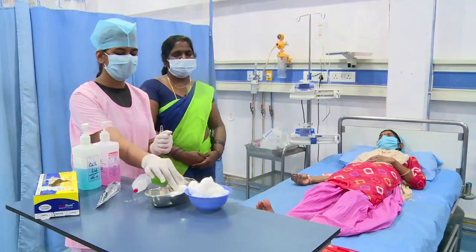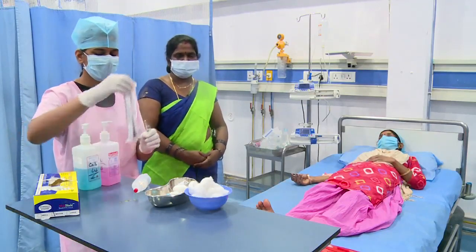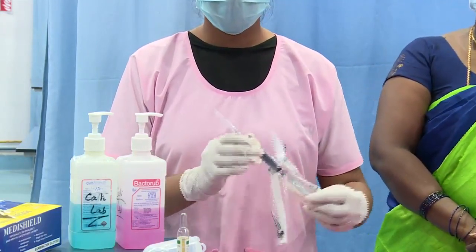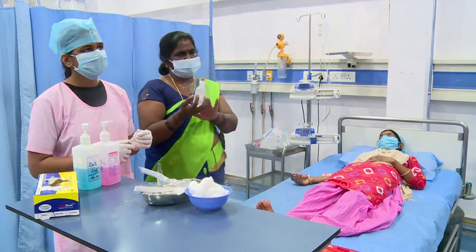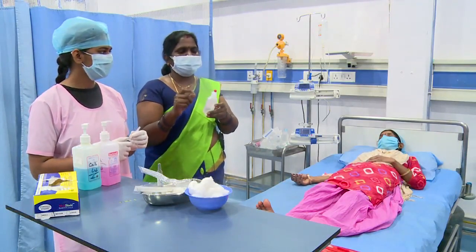After breaking the ampoule, she can withdraw the injection into the syringe. She can take 10 ml of dextrose from the 100 ml dextrose, then dilute the 10 ml of calcium gluconate in dextrose.